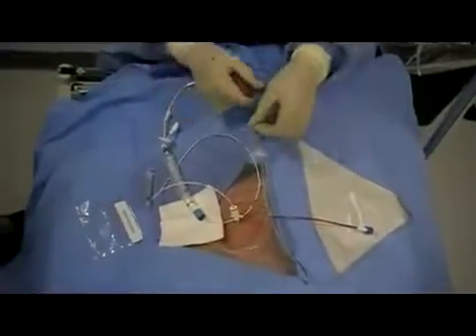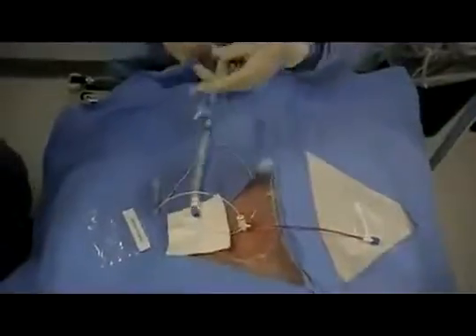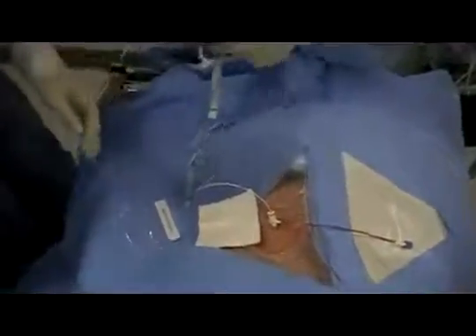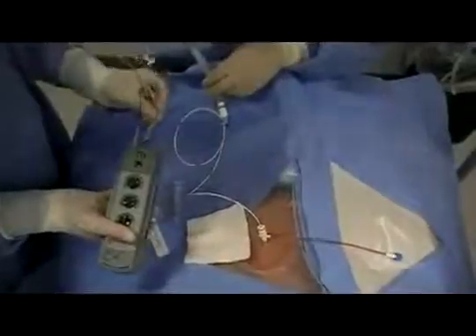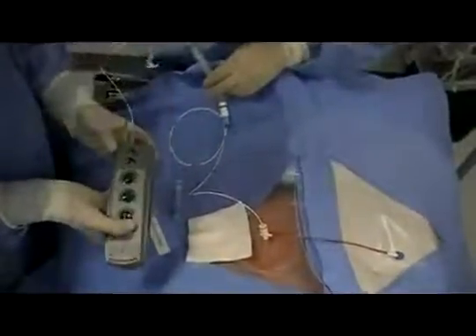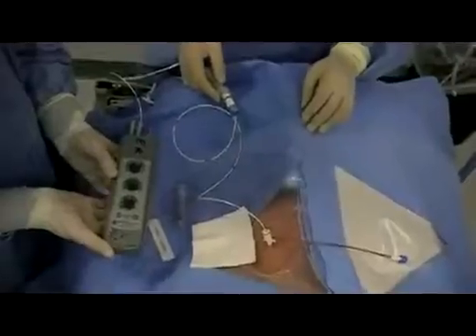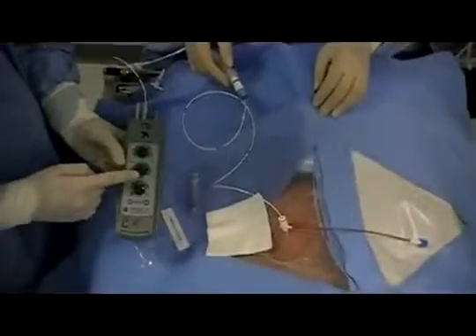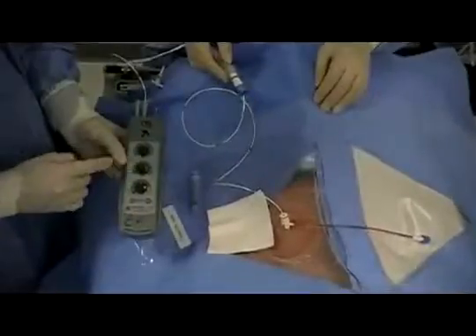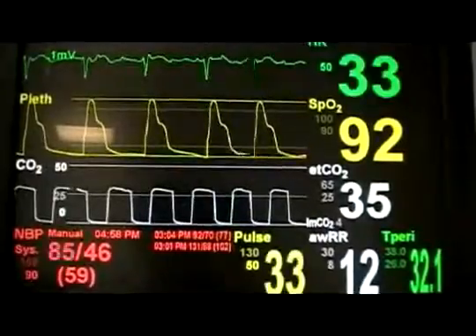Once the adapters are inserted, the distal end of the catheter can be handed off to a non-sterile operator. Ports should be inserted positive to positive and negative to negative. At this time, the pacing box can be turned on. The rate should be at least as high or higher than the patient's innate rate. As the catheter is advanced, watch the monitor for pacer spikes. The output should be started at a high level, and once capture is sustained, dial back to a level at which one loses capture, then dial back up to a minimum output to sustain capture.